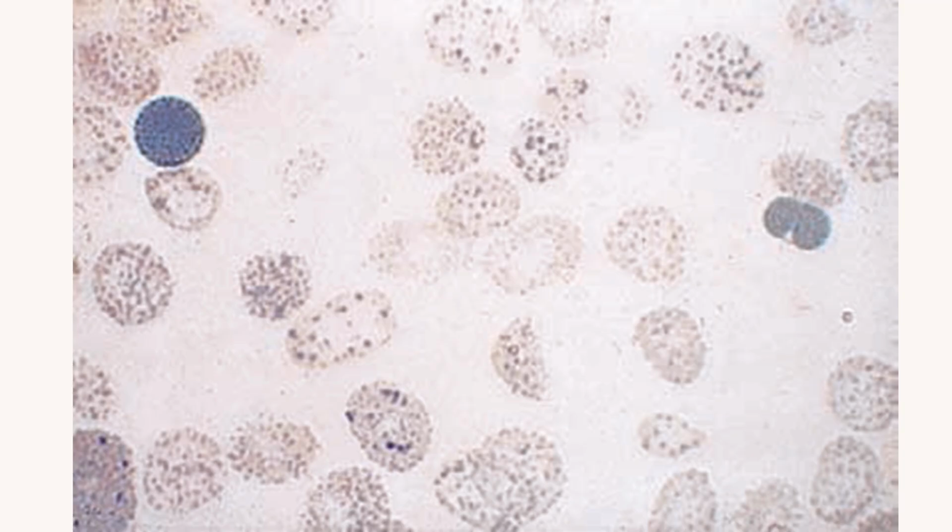So you have to examine approximately 50,000 red cells, or 200 oil immersion fields containing 200 to 300 red blood cells per field. Hemoglobin H bodies are multiple, evenly distributed bodies in the red cell that may be described as resembling the pattern of a golf ball.